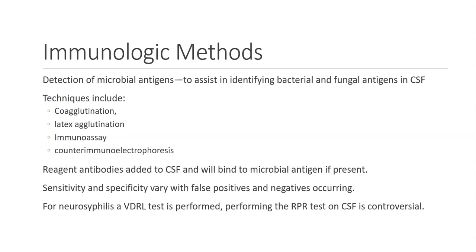For neurosyphilis, a VDRL test is performed. There's another type of test for syphilis that can be performed called the RPR, but in general, this test is not used for CSF.